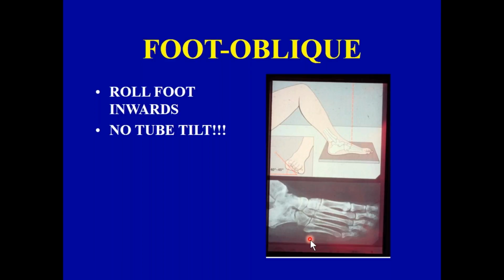So we're turning towards the big toe side to accomplish this oblique view of the foot. The lateral view, unfortunately, only gives us information on whether there is soft tissue swelling on the top of the foot, but you can see that when they take their sock off because it's black and blue, or there's swelling there. Swelling on the underside of the foot, on the bottom of the foot, is pretty hard to tell unless your patient says to you, I stepped on a nail. That's obvious. Or I was at the beach and I stepped on a shell, or I stepped on something really sharp, and now it's the bottom of my foot that is injured.